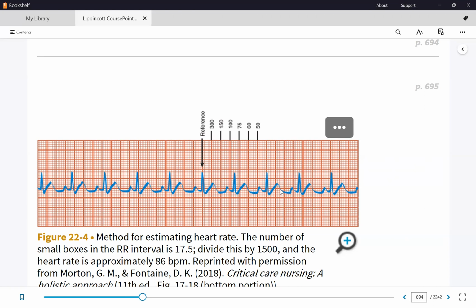Remember, this method is only an estimate. What is my true exact heartbeat? If I have to print an entire 60-second strip, but I only have 6 seconds. So therefore, is it acceptable? Yes, estimate. Remember, these are estimates. The only true accurate count is a 1-minute strip. Okay, so that's one easy method.